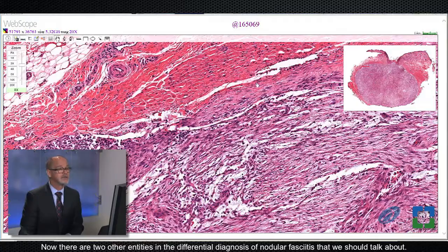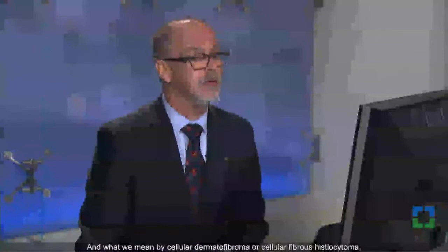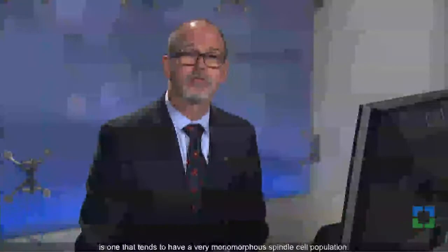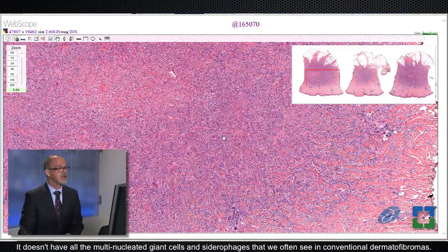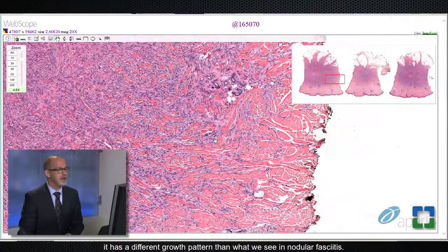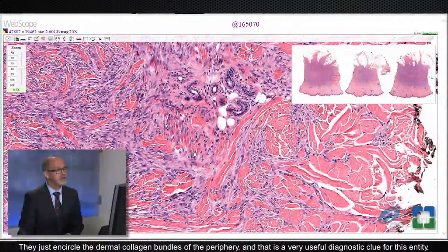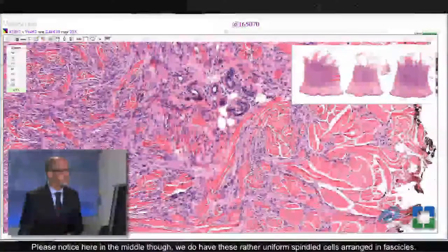There are two other entities in the differential diagnosis of nodular fasciitis that we should talk about. The next one is essentially a dermatofibroma — a cellular example of a dermatofibroma. What we mean by cellular dermatofibroma or cellular fibrous histiocytoma is one that tends to have a very monomorphous spindle cell population. It doesn't have all the multinucleated giant cells and siderophages that we often see in conventional dermatofibromas. Notice at the periphery, the tumor cells are wrapping around or trapping the reticular dermal collagen — they just encircle the dermal collagen bundles at the periphery, and that is a very useful diagnostic clue for this entity.